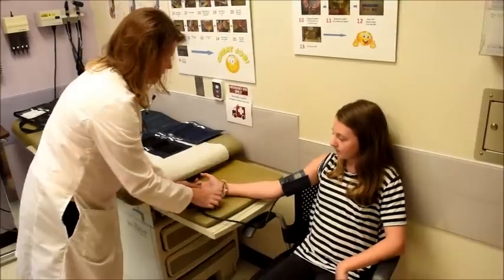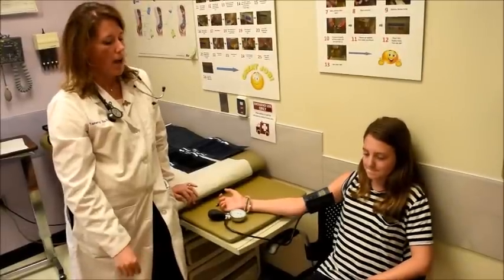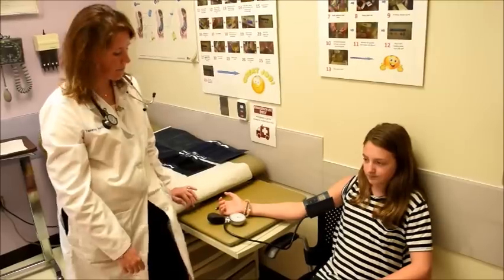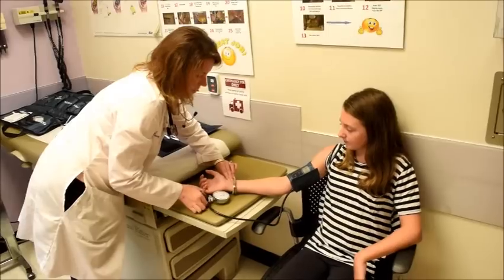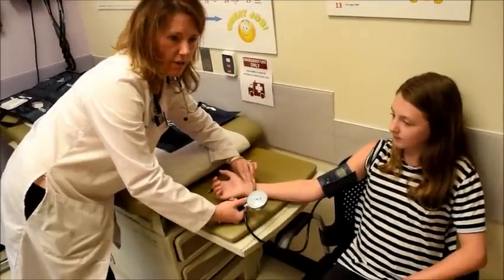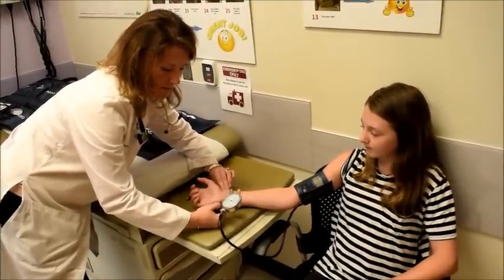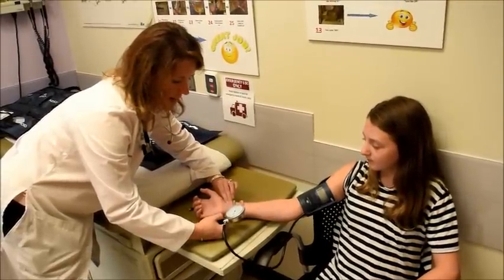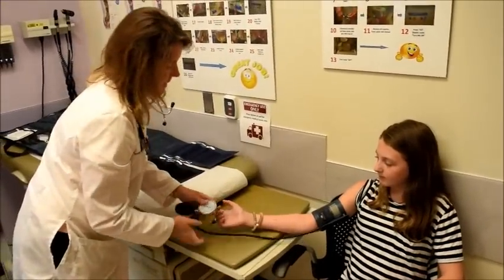And so now what you're going to do is determine what the pulse obliteration pressure is. And that is an important number to know, because that's going to help you determine how far to inflate the sphygmomanometer. So determine the pulse obliteration point. You want to palpate the radial artery, and you're basically going to inflate the sphygmomanometer to the point where you no longer feel the radial artery. The best way to do this is to pump and feel, pump and feel, pump and feel, pump and feel. Okay, and so for Chelsea, that is 90. So the pulse obliteration level for Chelsea is 90.